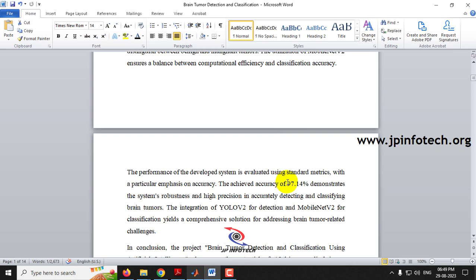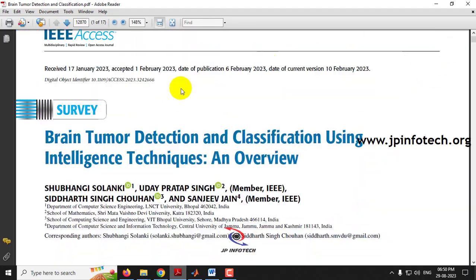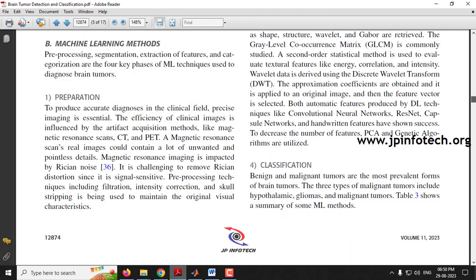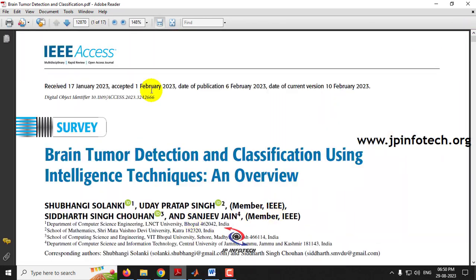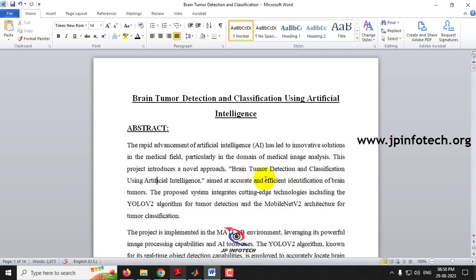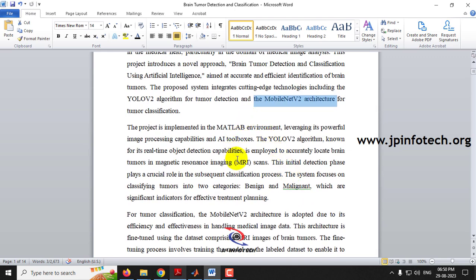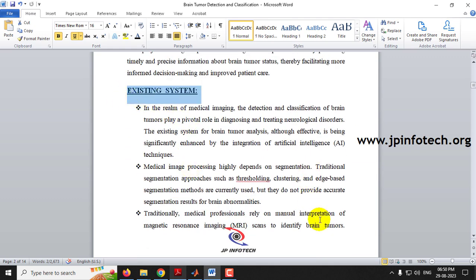We have achieved an accuracy of 97.14%. Note that the base paper is a survey paper listing all brain tumor detection work done by various authors, so we cannot implement all techniques with all datasets. We are implementing only YOLOv2 for tumor detection and MobileNetV2 for classification, using MRI scan (Magnetic Resonance Imaging) images. This is our proposed abstract.